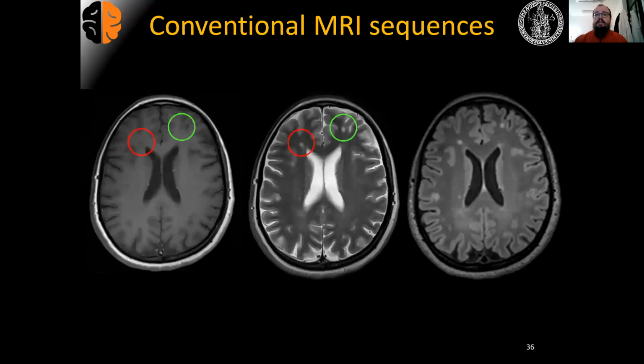You can also decide if you want to subtract, so take to 0, the signal of the CSF, which you can see in the image on the right is black, is hypointense. And why do you want to do that? Because in doing so, you can also enhance even more the pathological characteristics of the tissues in case of disease.